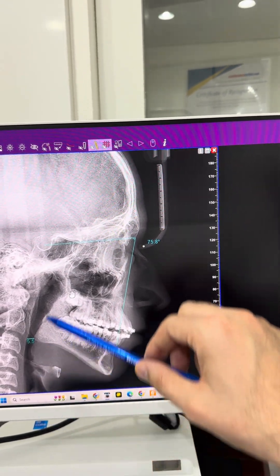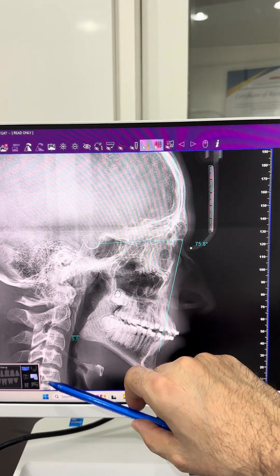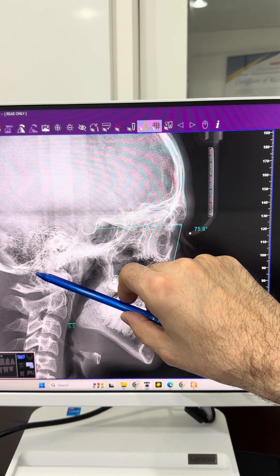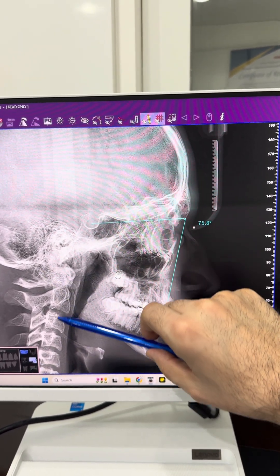Once we see such a narrow airway, we should always think about expansion. You can also see the reverse curve of the cervical spine, which is called kyphosis — it should normally have a backward tipping.